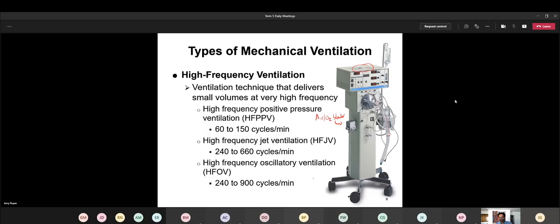So as you see, this machine, after all these years, they still haven't designed it where it's just a knob that you turn and the machine will take care of all of this on the inside. So this is still something you have to set up yourself and just connect into the system, and that way you get the oxygen delivered. The machines in the lab have an internal blender system.